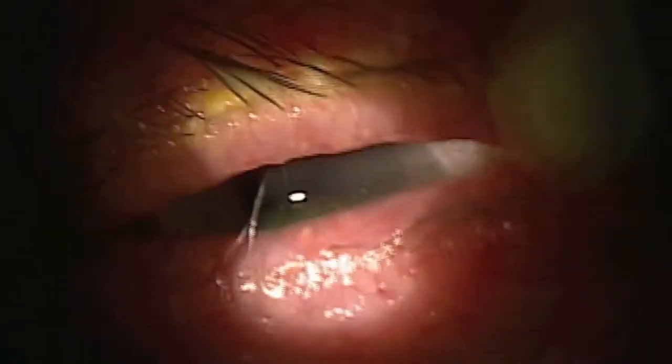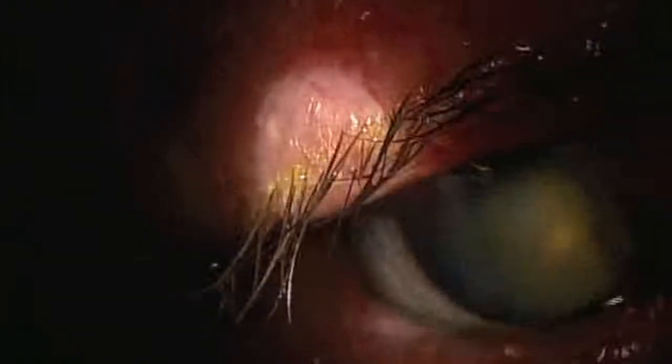A fresh tip is placed on the BlefX handpiece and we turn to the upper lid. Most patients report only a strong ticklish feeling sensation, but it is usually well tolerated.